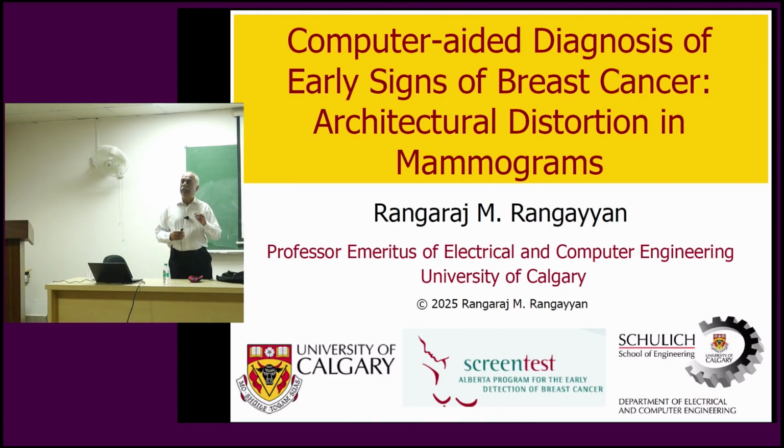As I mentioned, in a screening program, women in a certain age group are invited, voluntarily, to come and get their mammograms taken. In Canada, it is from 40 years to 70. So women are asked to come every 2 years to get mammograms done, 2 per breast, the CC and MLO views. I'm not sure if digital breast tomosynthesis has been incorporated yet into the screening program in Canada, but in some parts of the US, that technique has also been included. And CAD systems have also been included in some screening programs.